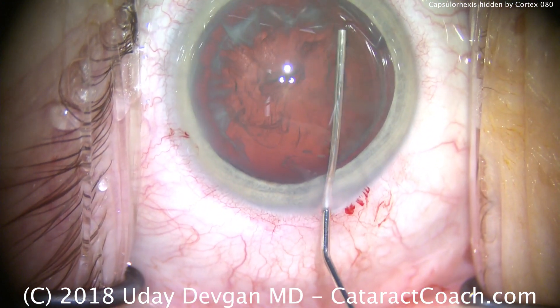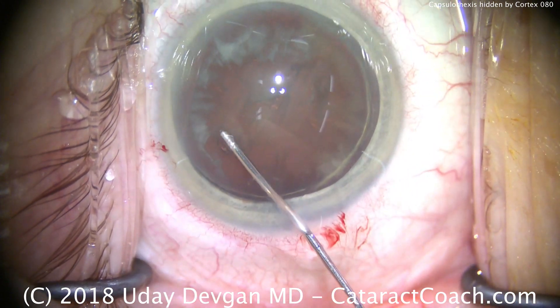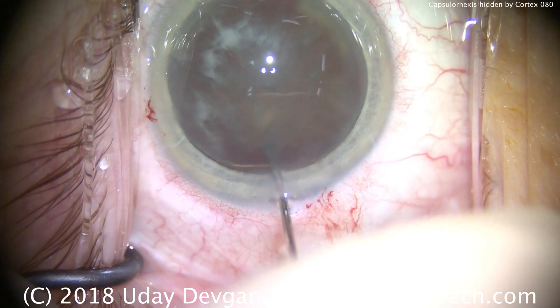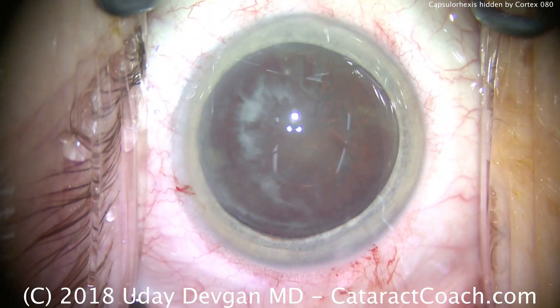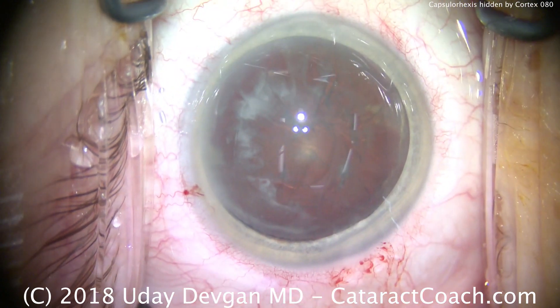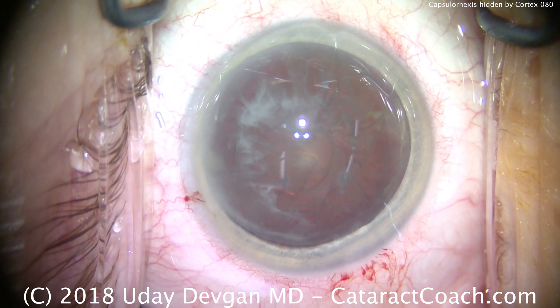Now that I know I have a complete capsulorhexis, let's do some hydrodissection. Look at the incision — notice how we've lost a little viscoelastic. This is the reason why I like to put a little extra dollop of the dispersive viscoelastic prior to putting the phacoprobe in the eye.